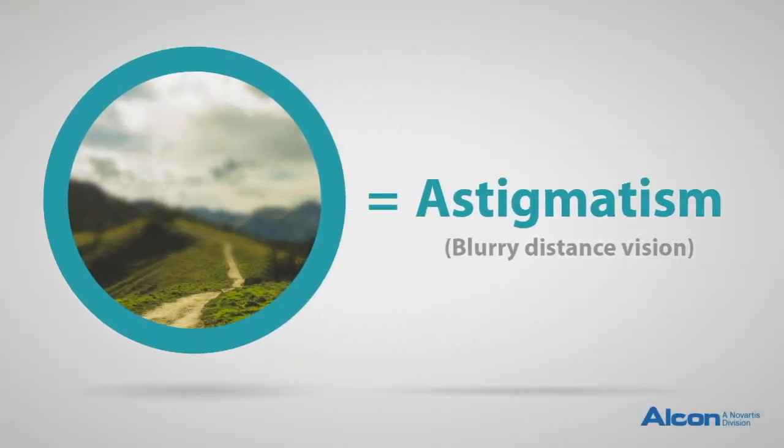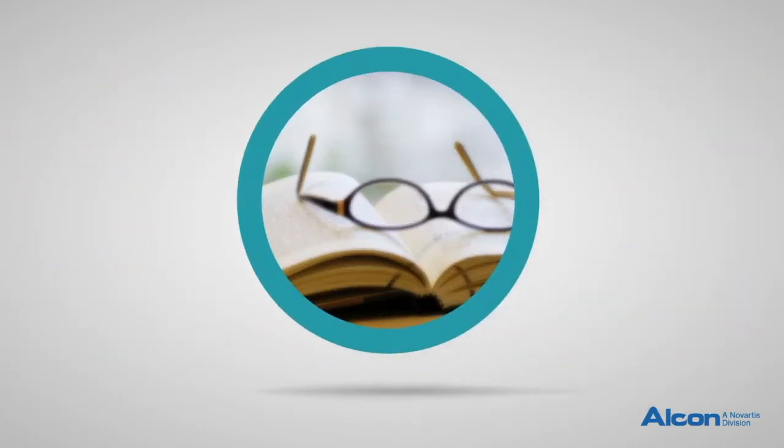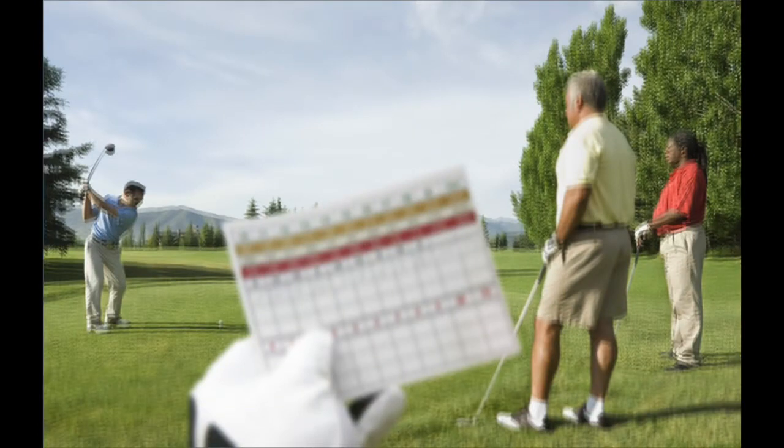We also offer different lens choices. There's a standard lens which is covered by insurance called a monofocal. Monofocal has a uniform focus to it, generally designed to reduce distant prescription. However, it does not correct for two important things, which would be astigmatism or presbyopia, or the loss of near focus. So patients after having the monofocal generally have to wear glasses for both far and close, usually in the form of a bifocal type lens.